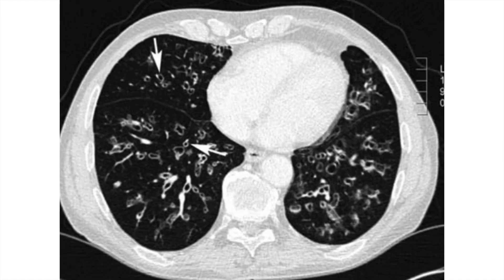Finally, this is bronchiectasis. The sign by which we can differentiate it from cysts is if you scan the CT scan, you will find some of the cysts are having a signet ring appearance — this is the presence of the pulmonary arteries accompanying the airway, giving the bronchus the appearance of a signet ring. The presence of this indicates that this is bronchiectasis and not a cyst.